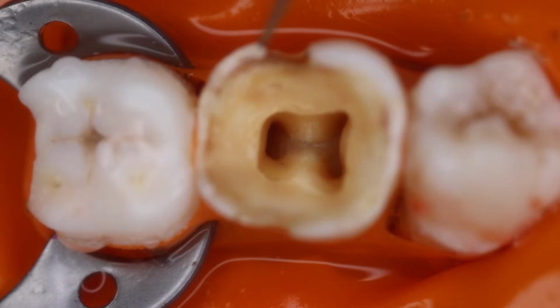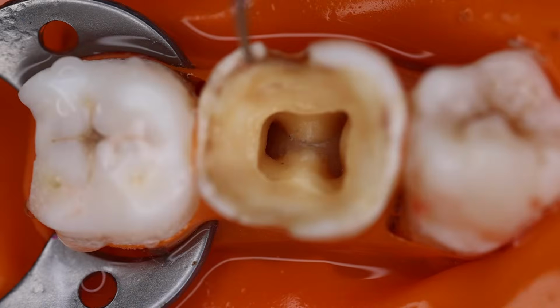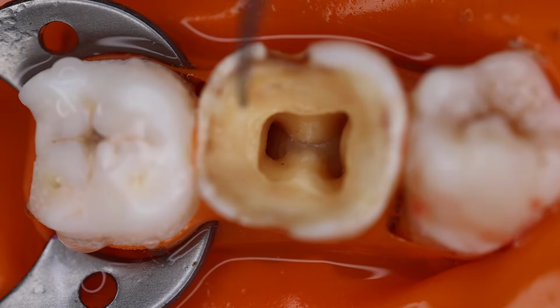These walls are a little fragile and liable to break, so we should remove them, as we need a reference point. Once we enter with the endodontic file, these reference points are weak, so we should remove them and maintain healthy, sound tooth structure as much as we can, which would act as a reference point.